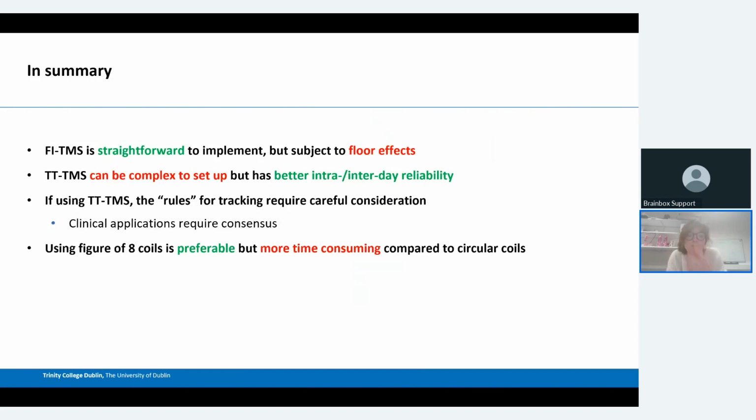And really, if we're moving towards clinical applications, for example, using these as diagnostic tests, we should try and work together to converge upon a consensus as to what is the protocol that we should use consistently across sites. And figure-of-8 coils are preferable, but more time-consuming to use compared to circular coils.